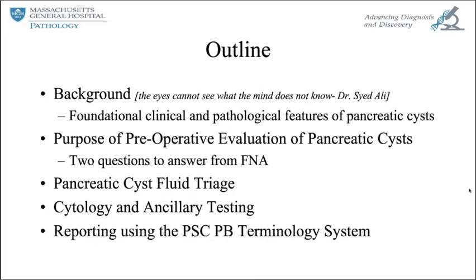We'll move on to the purpose of preoperative evaluation of pancreatic cysts and address the two questions our clinical colleagues want to know from FNA of pancreatic cysts. And then we'll follow up with how we answer those questions. How do we triage pancreatic cyst fluid for optimal information from that usually scant specimen? What ancillary tests can we add to cytology? And how do we report these results so that the patients can get the care that they need?